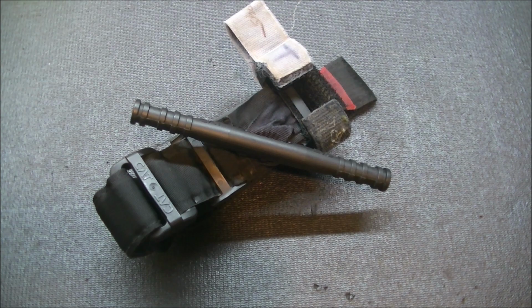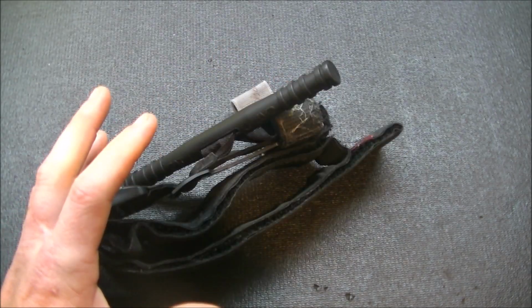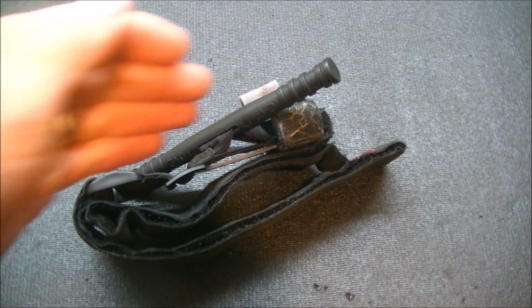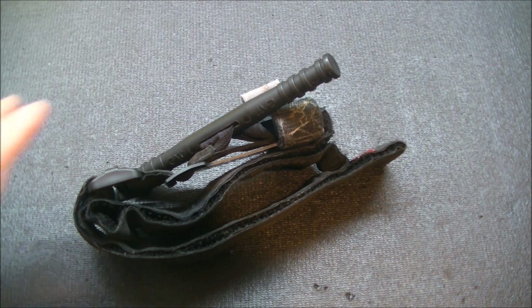But if you just don't have enough of that, or it's not working, like when it goes around a big thick leg, then it can still be undone. It can just be ripped out from friction or something like that if you're not able to secure it properly or well enough. So there's some risk there, and I've seen it happen when they were being used for real, like being seriously used for somebody who was bleeding out. So let's go ahead and move on to the SOFTT-W.